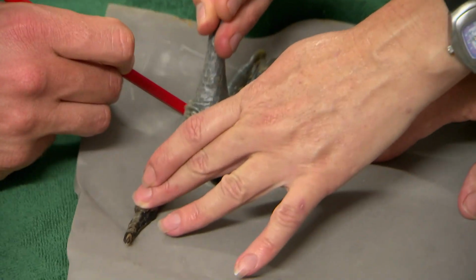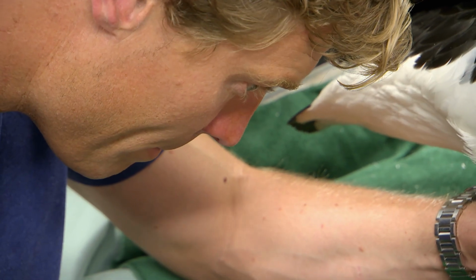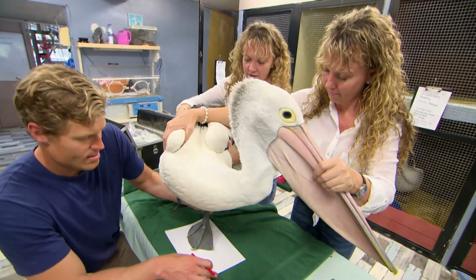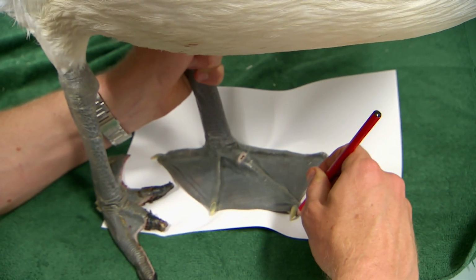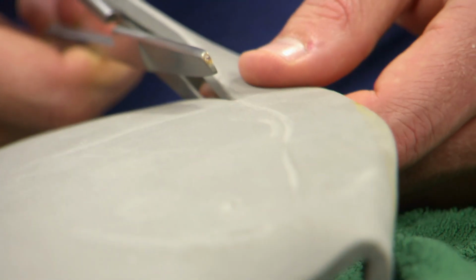Okay. So now, go right around it. First of all, Chris needs to make a protective base for Flipper's injured foot. So that is a good starting point. Then, with the help of a reverse template of the Pelican's good foot, he can start to put together his master plan. We love Chris's idea of the flip-flop for Flipper's foot, and we think it is going to work.